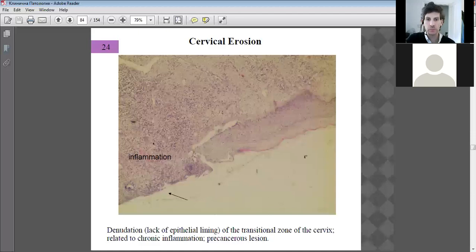And the rough border, the sloughing of the tissue occurring along the border, is evident. The transitional zone of the cervix is where the cell division occurs, just below the surface, in this area here. I can see some examples of necrosis happening over there, necrotic tissue forming there, some there. Okay, so it looks like damage from an invasive agent, perhaps a virus.